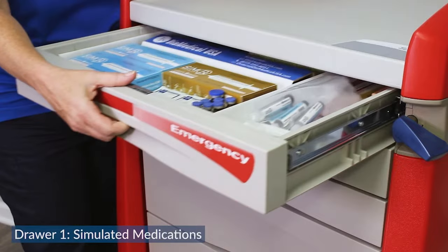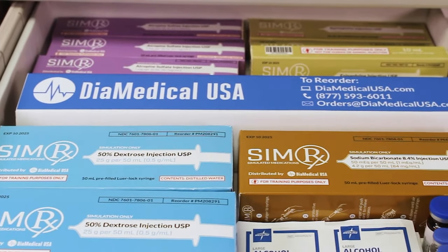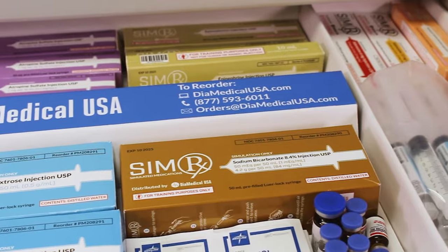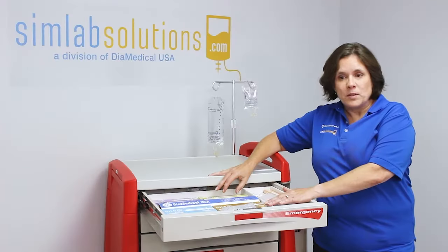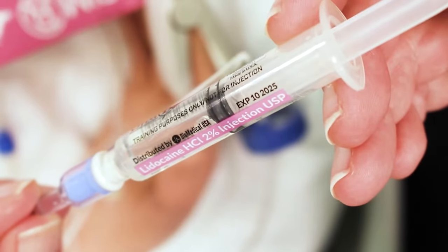The top drawer contains all of our first line code medications. These are the ones that we use right away when a patient isn't breathing or doesn't have a pulse. These are SimRx simulated medications, manufactured by SimLab Solutions. All of these are color-coded and can be administered quickly and easily.